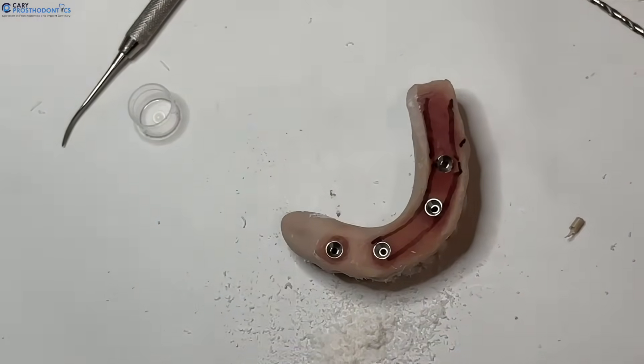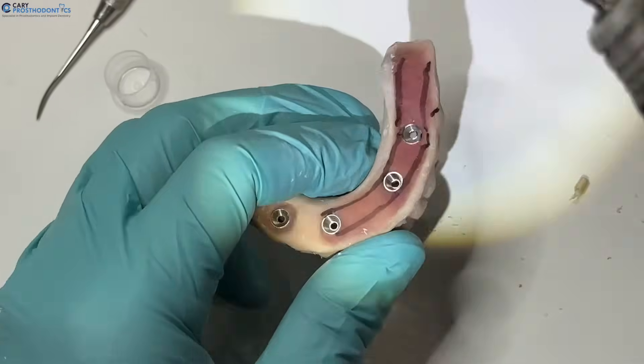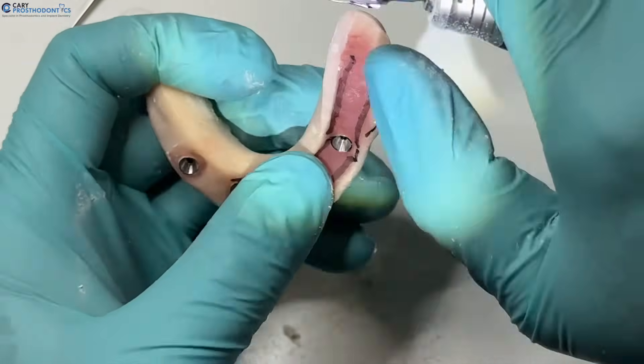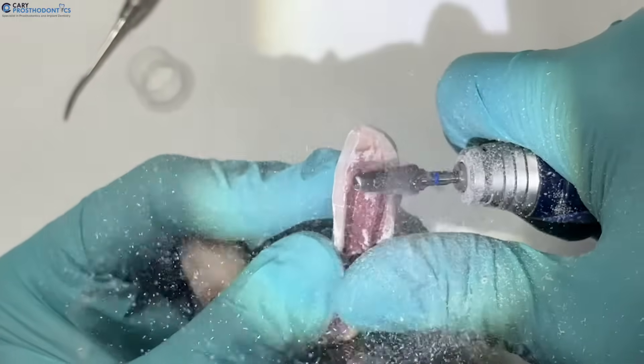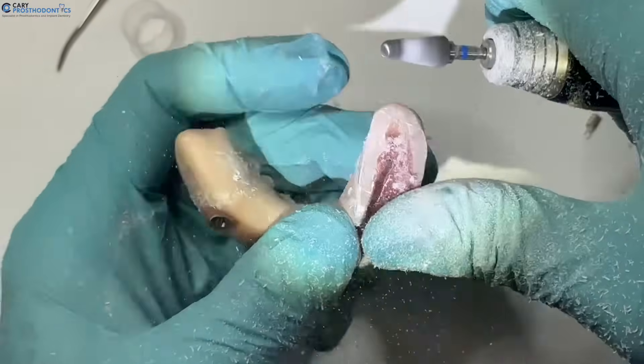Now we're going to switch to the second drill — this one is good for bulk excess. For this material, which is printed resin, don't push too hard because it's pretty brittle. I'm going to remove everything I don't need.